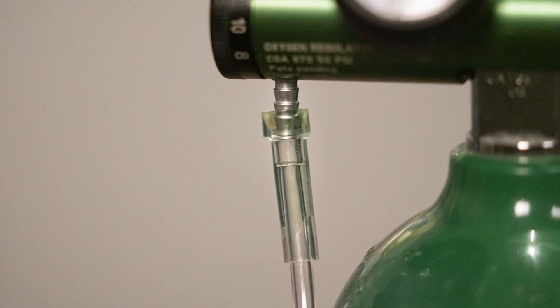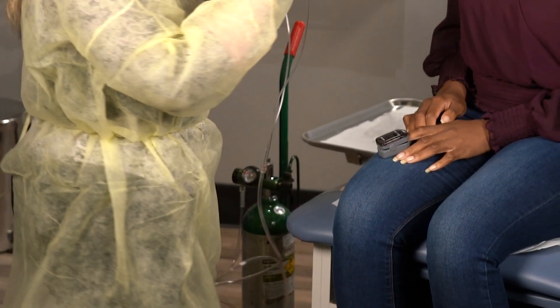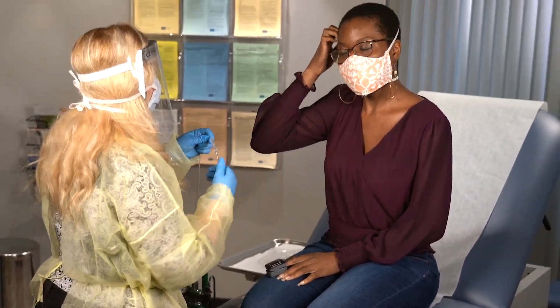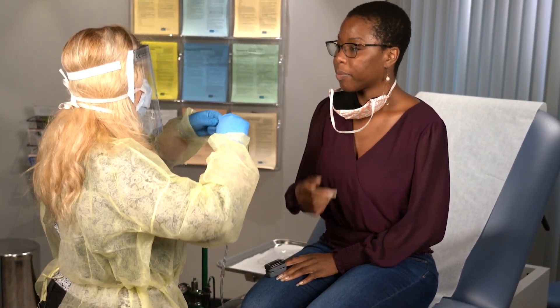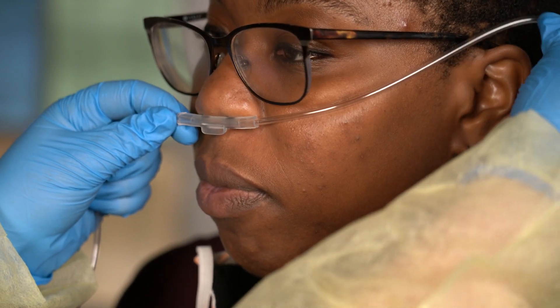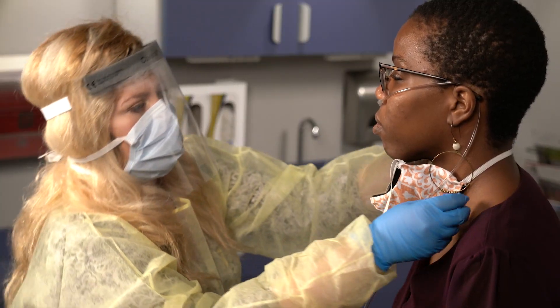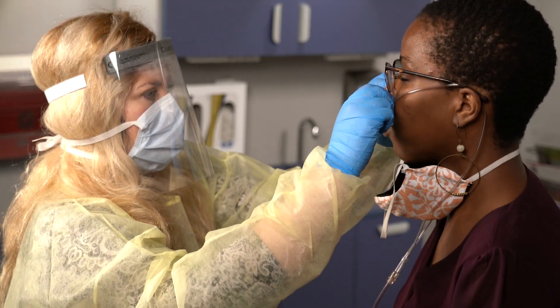On the oxygen tank, there's a port that connects the tubing for the nasal cannula or a mask. The oxygen moves from the tank, through the regulator, and out through the tubing. It then reaches the patient via the nasal cannula or mask. It's important that the connections are tight and secure so the oxygen can flow properly through the tubing without any leaks.